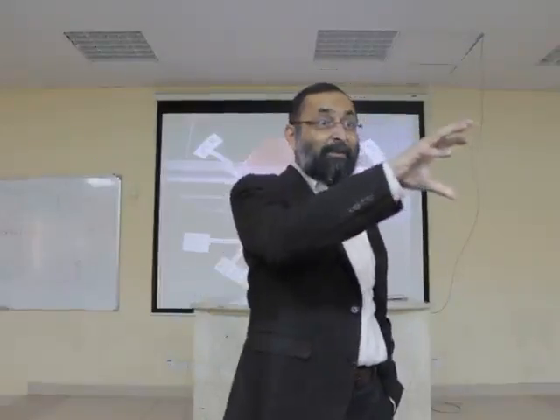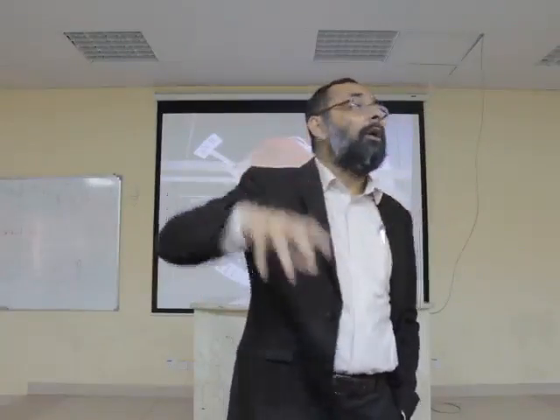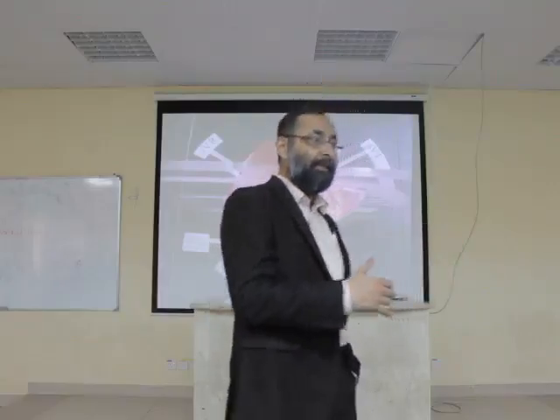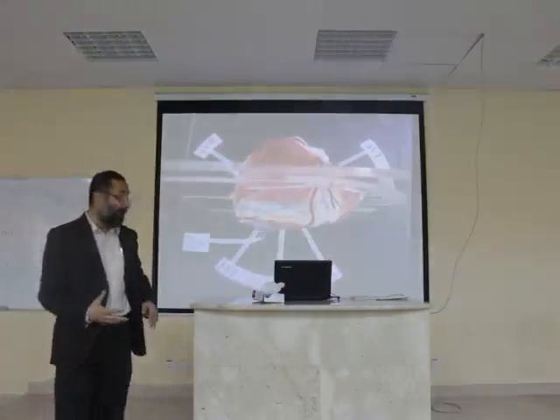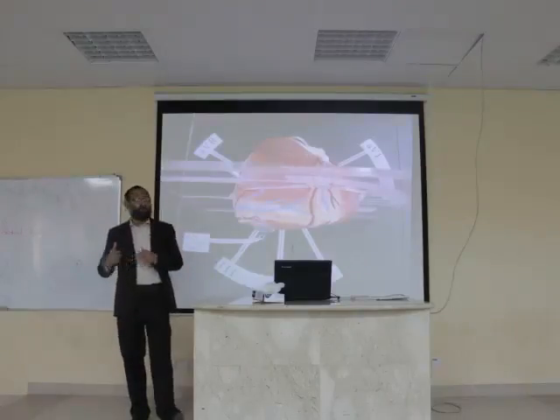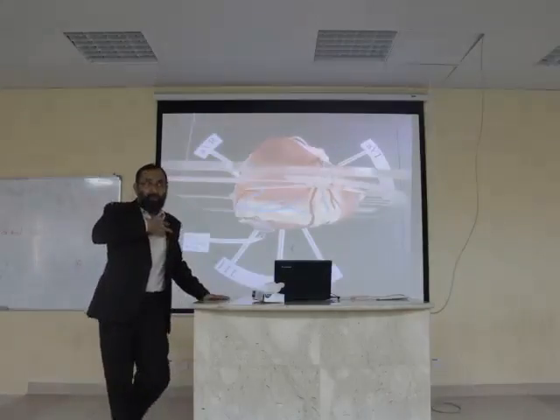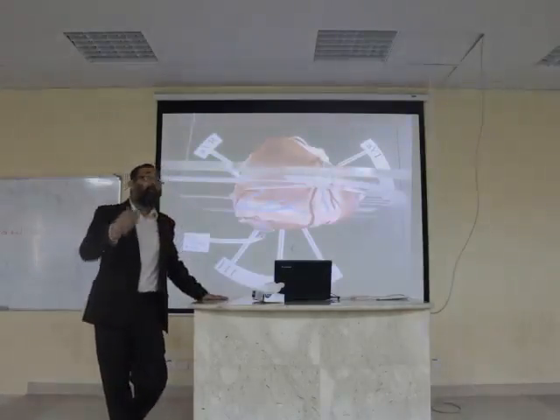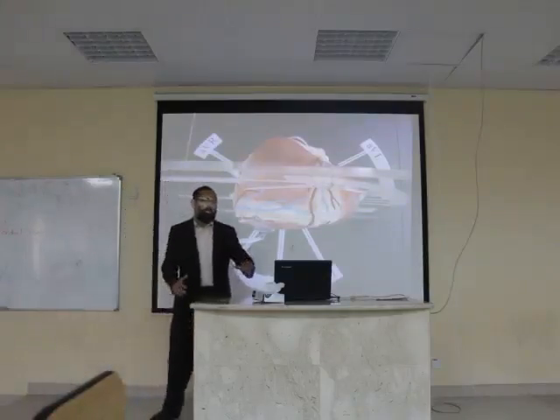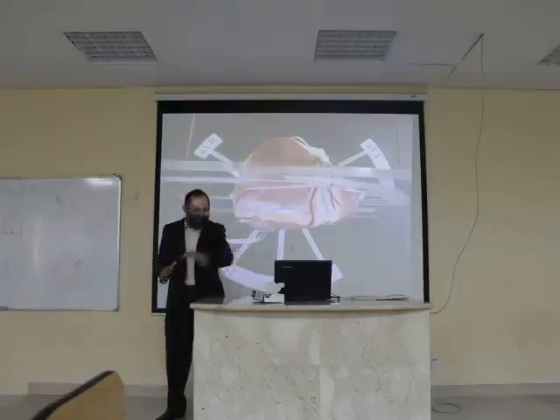Time, but it is very specific for recording the right atrium or left anterior descending artery problems. So far, if you see the books, you will not find the discussion of the AVR. You will find all others, but AVR is the least considered. But now it's an emerging concept that AVR is specific for some diagnoses, and these are for some problems of the coronary arteries on the right side, and for some drug toxicities like tricyclic antidepressants and others. Anyway, AVR in our discussion is least concerned.